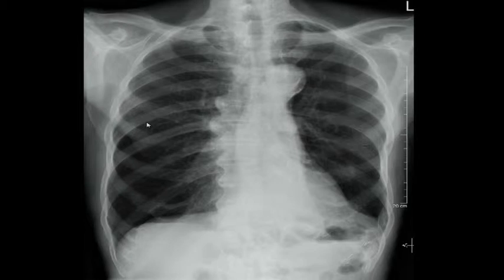Okay, the patient may have had previous gastric surgery. Any other abnormality in the chest? So this also is an exam case. It's like a spot diagnosis, like an anatomy spot. When you don't see anything else, you have to look for that. Okay, no worries, you're only in first or second year, so that's okay.